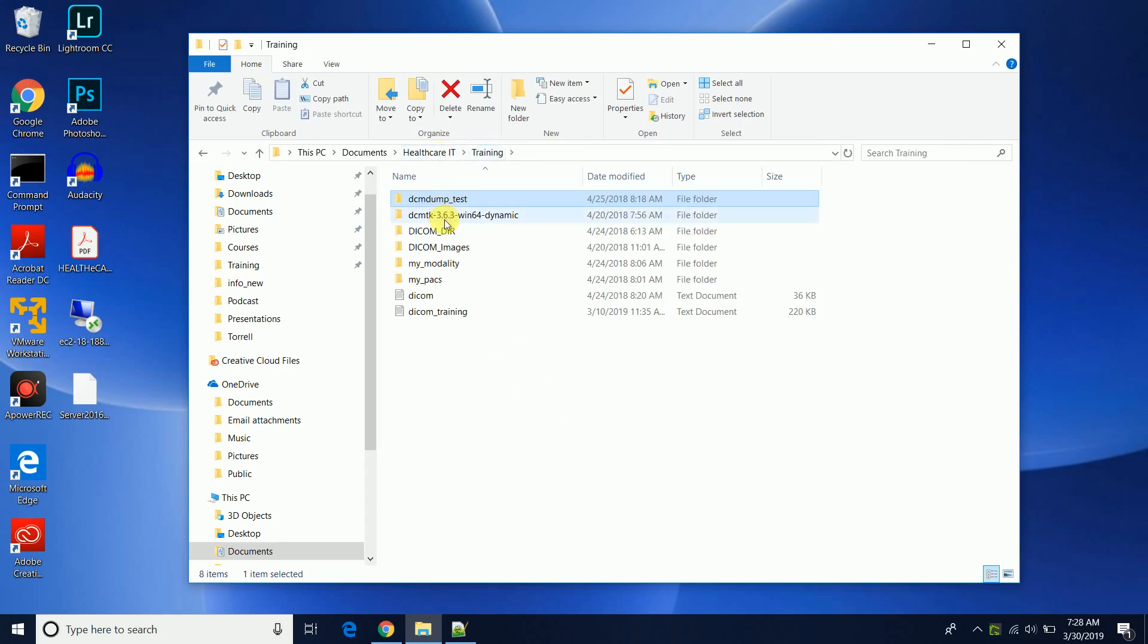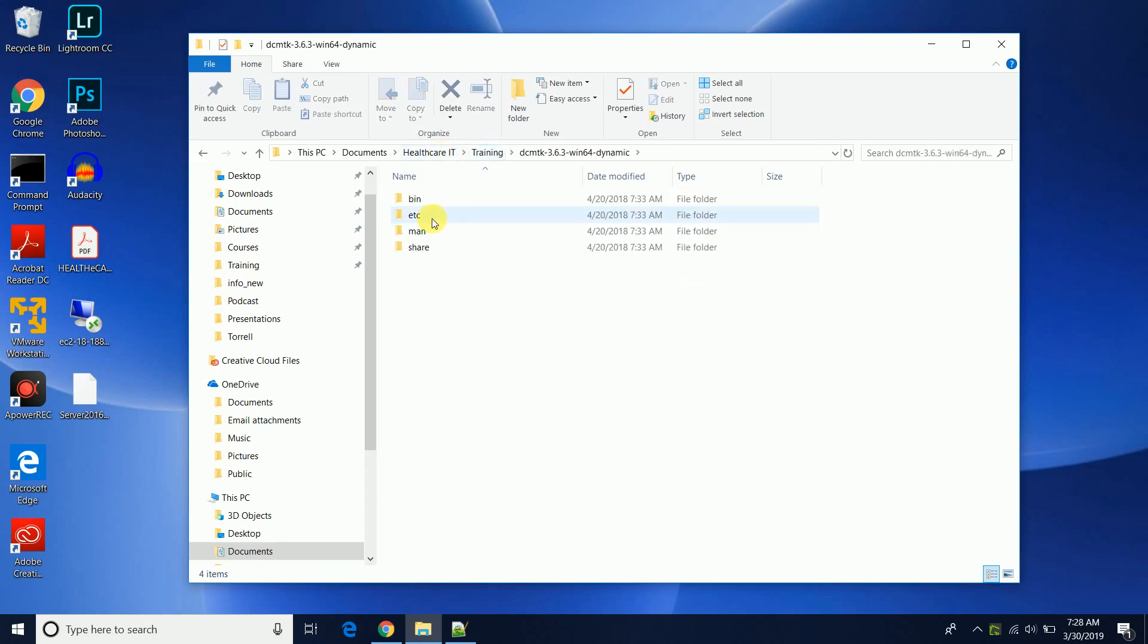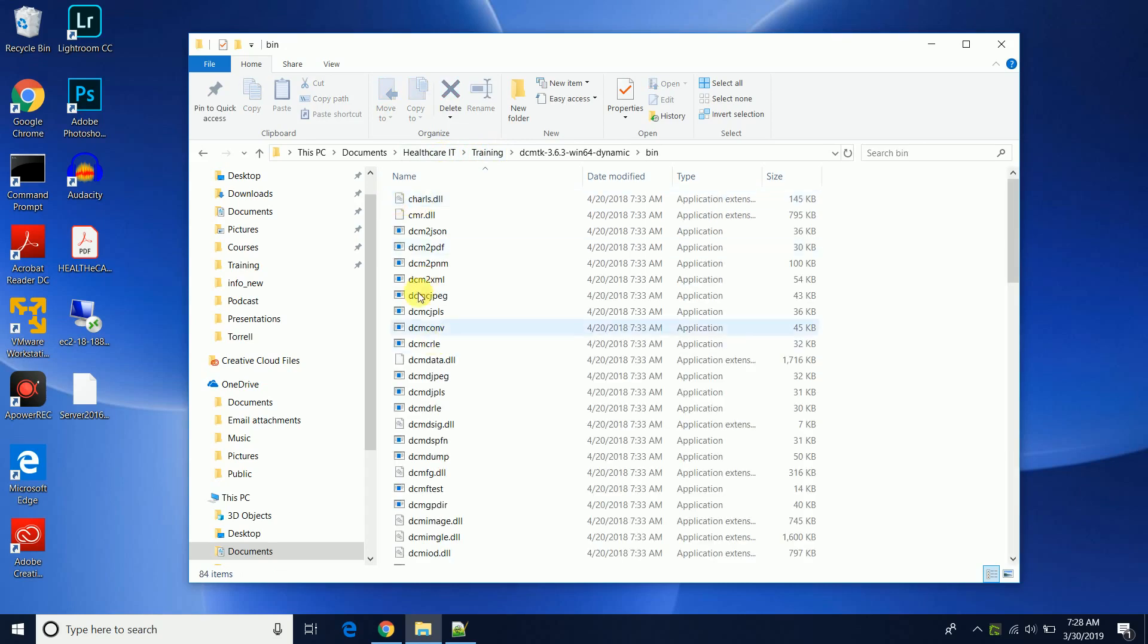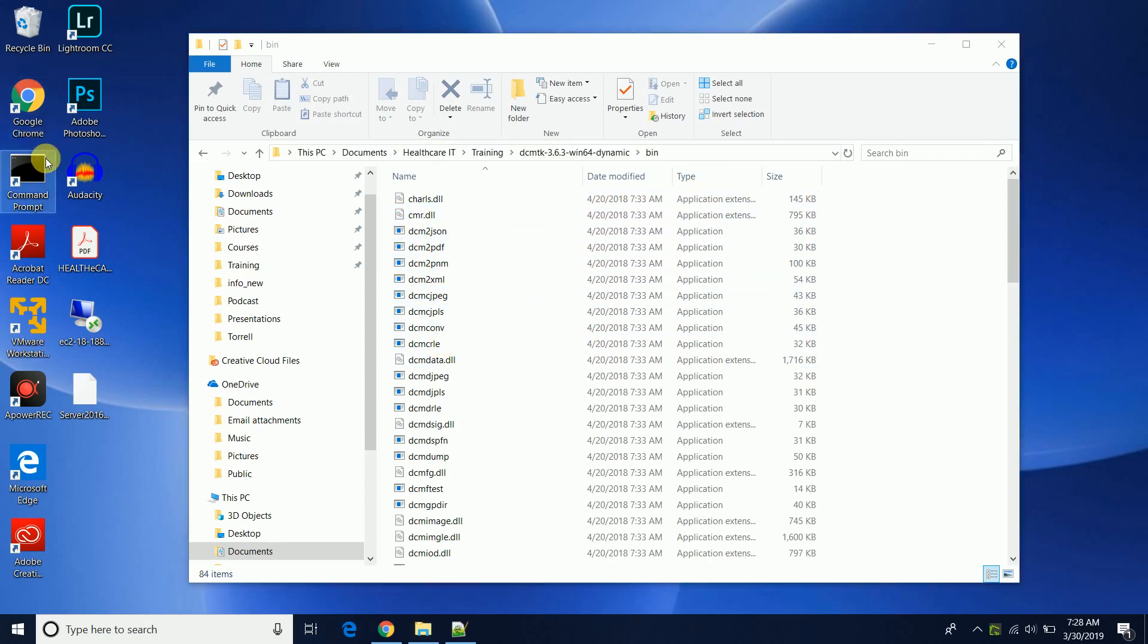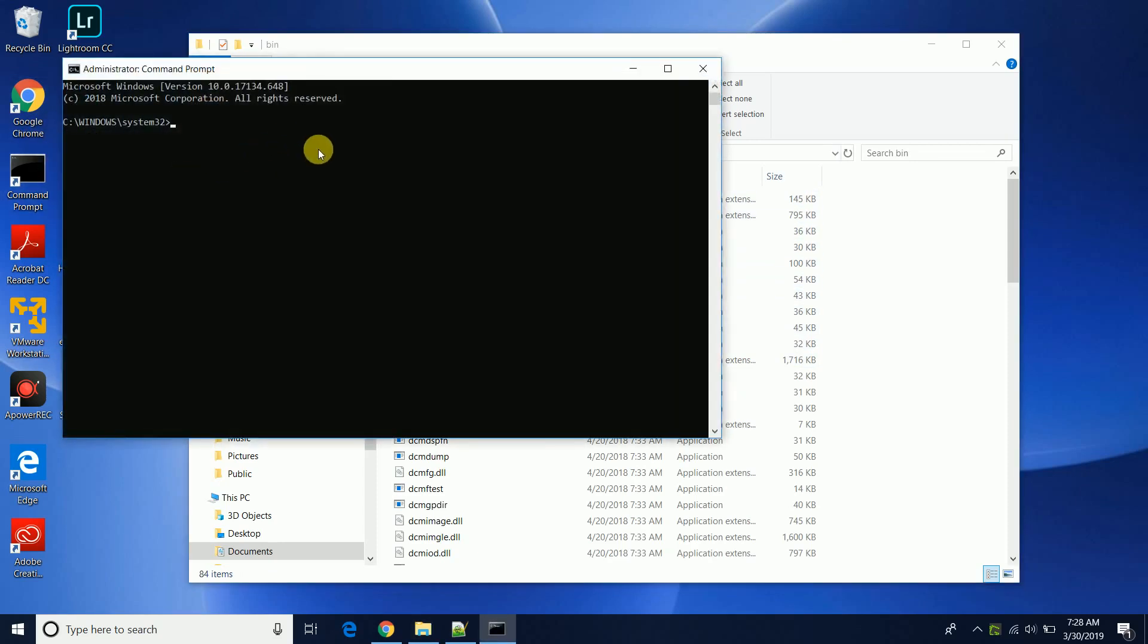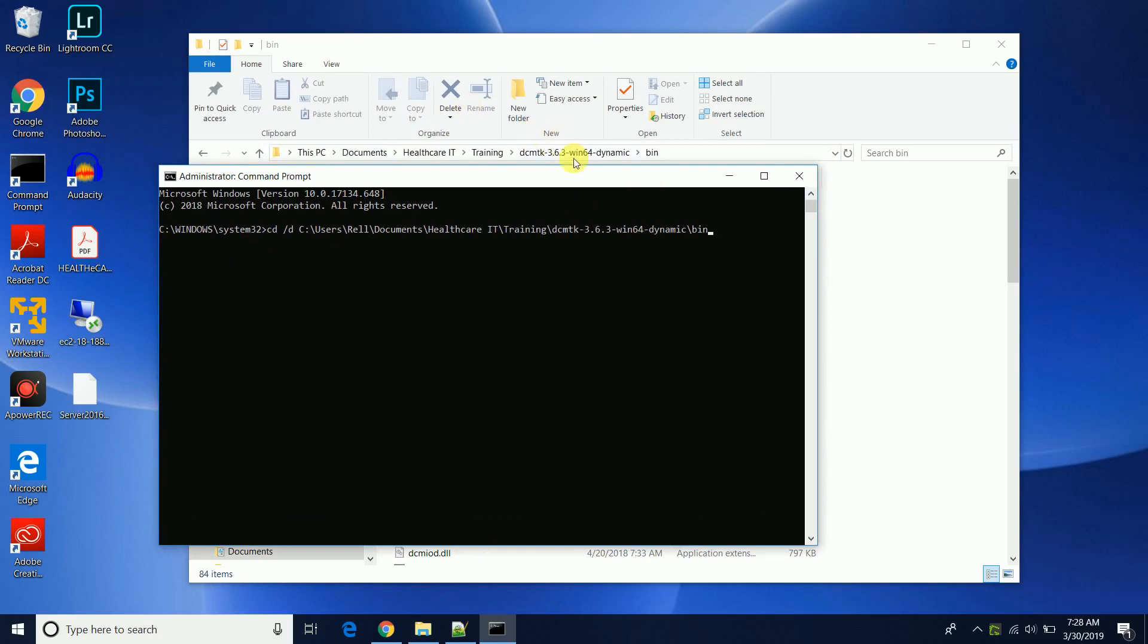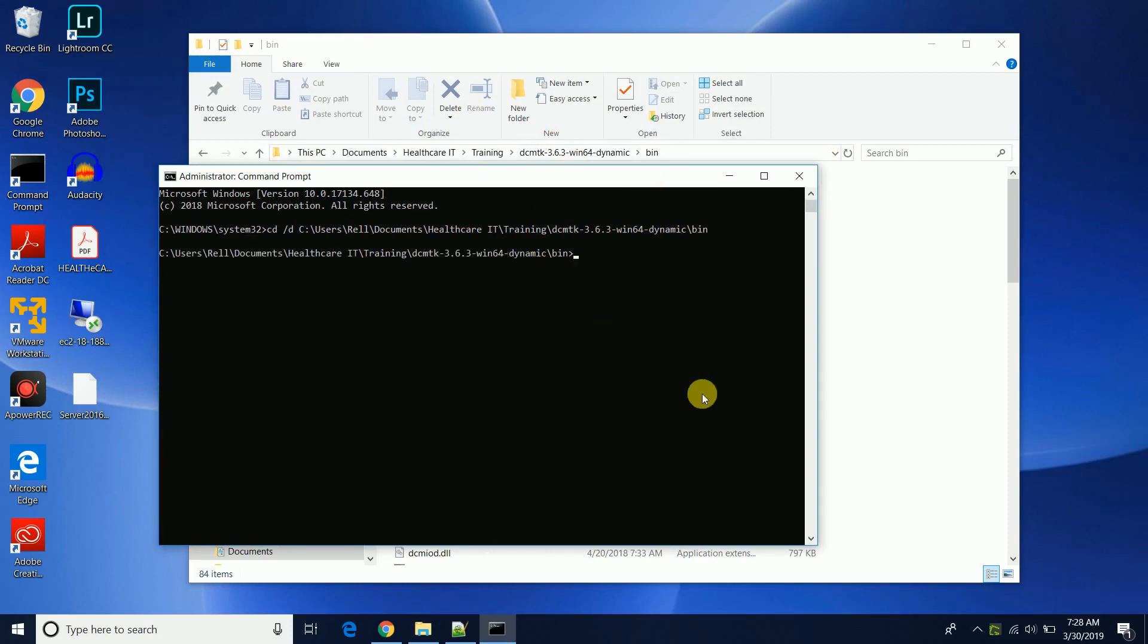So what I'm gonna do is come back to DICOM toolkit folder, go in the bin directory which is where all of the executable applications are, and I'm gonna just open up command prompt, change directory. We're gonna copy and paste that location.